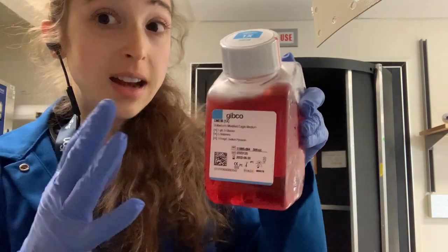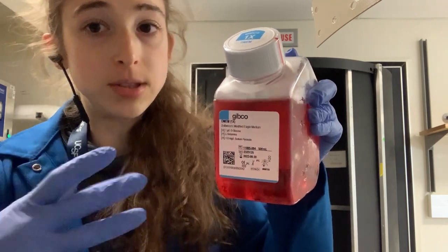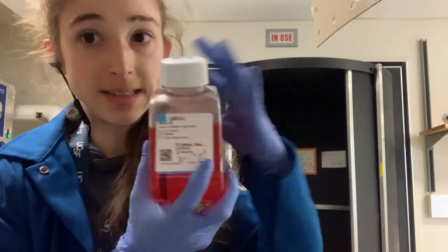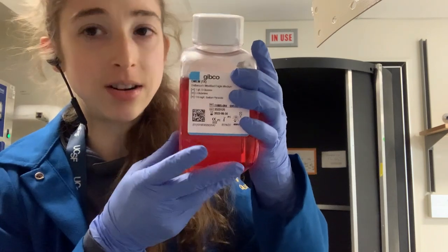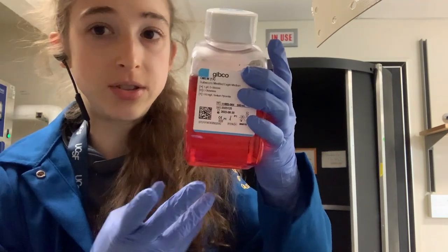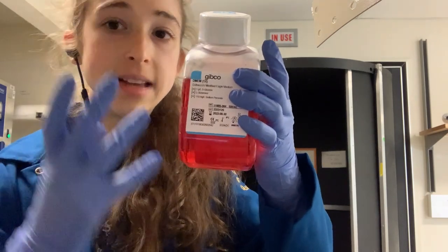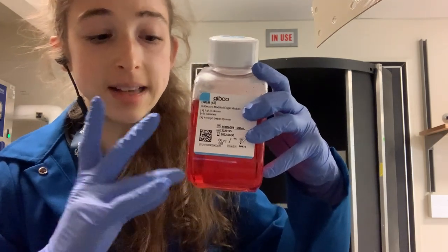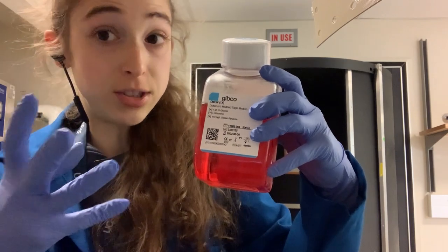There's also a push to get away from FBS — to get away from serum. Basically, this media has the basic nutrients: it's got the salts, it's got the pH stabilizer, and different ones have like different buffers. So they might have a sodium bicarbonate buffer, and that's why the pH indicator is really important — these media are designed to be grown at a certain CO2.